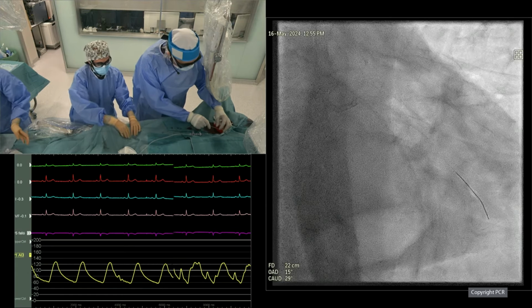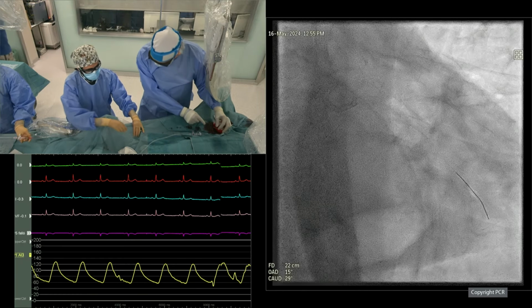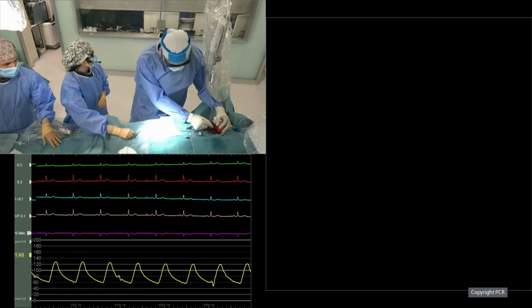Perhaps when you are at your ease, Nieves and Javier, you are highly experienced with this tool. What is actually the chance of side branch jeopardization when using orbital atherectomy? Can we safely do this procedure? I would say that similarly to rotational atherectomy, very low. I think that in general, it's a very safe technique for that. What would you say, Nieves?